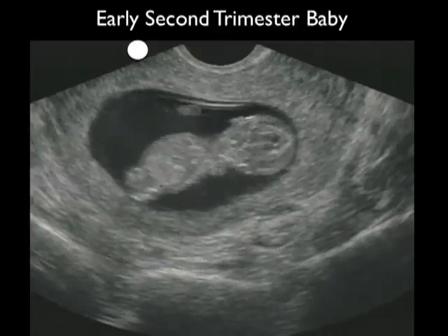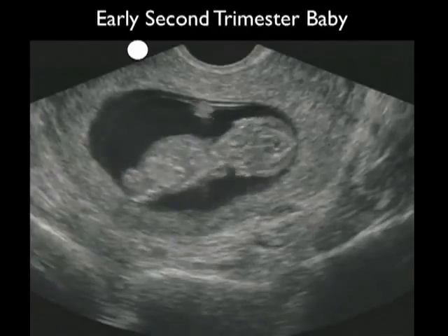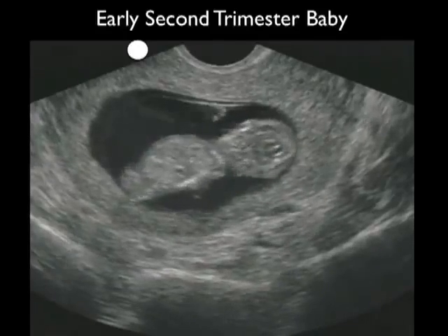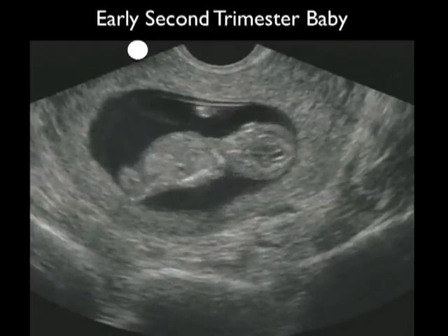Here's another second trimester baby, and as I work in northern Manhattan, I refer to this baby as the merengue baby. And note the baby moving around fluidly within the amniotic sac. A sure sign that this kid will grow up to be a slick dancer.